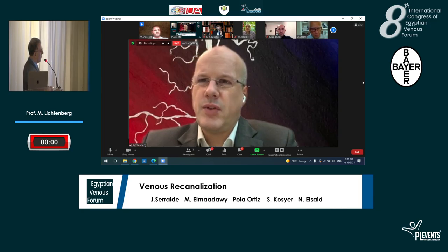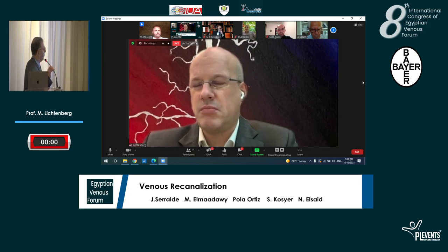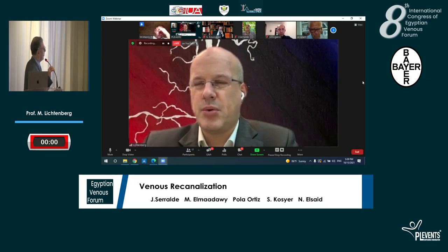On the other hand, oversizing is also an issue. We learned that especially oversizing could be an issue for young ladies, not obese patients. They are coming back with severe back pain or pain in the groin. So proper sizing is definitely important.